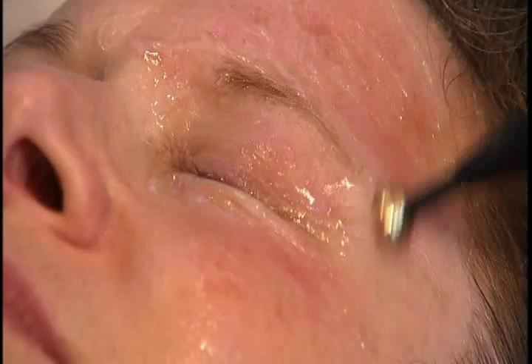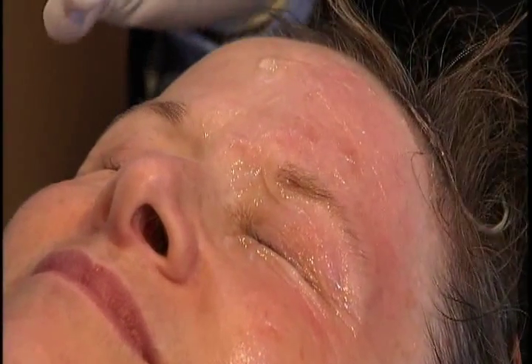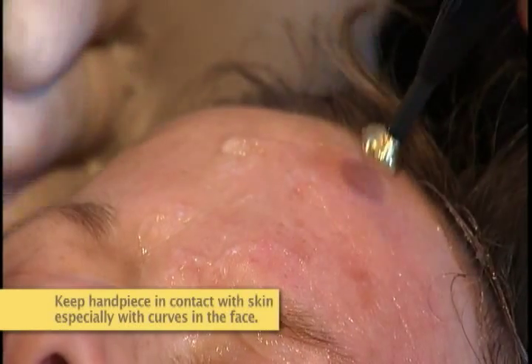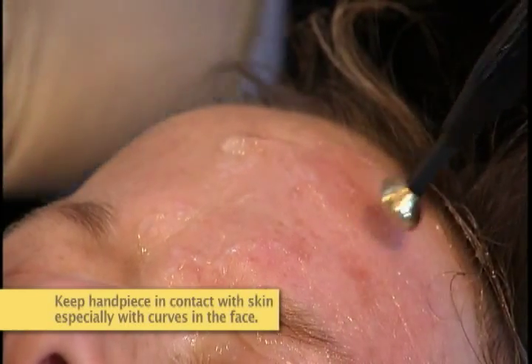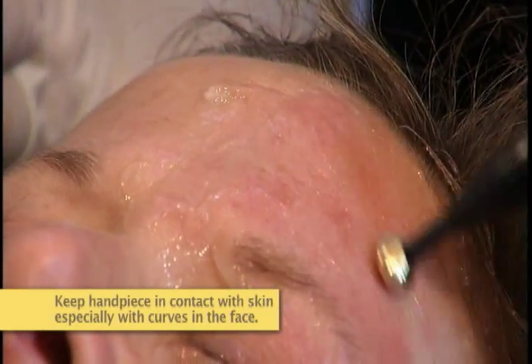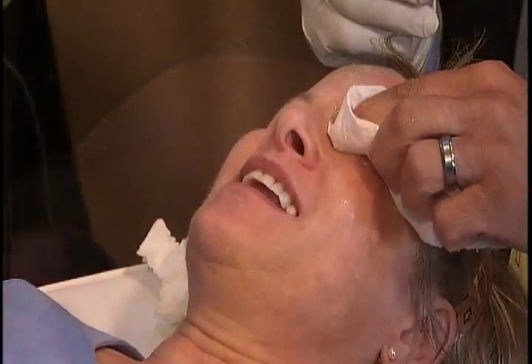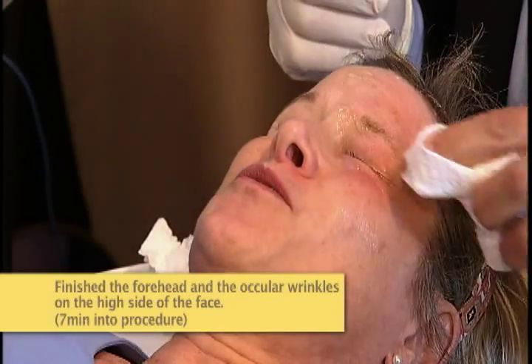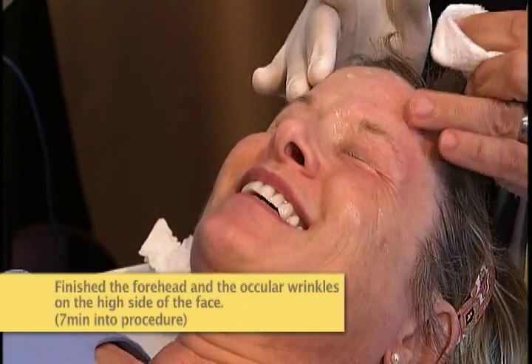That brow keeps twitching up every time I get near it. That's a nice response. The firmness is something we can't show you. You just have to get used to it. But if I were airbrushing and barely touching, she would constantly get a little zap. So you really want to be firm enough not to lose contact, especially as you go around a curve like this. You don't want to jump off. And I can actually feel my skin feels firm from this end. You can already feel that tightening in the brow.